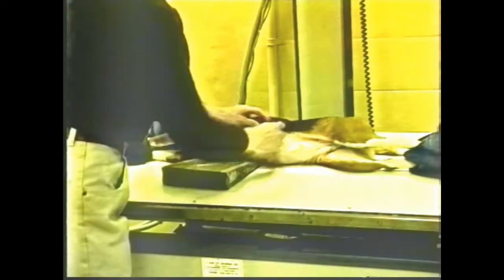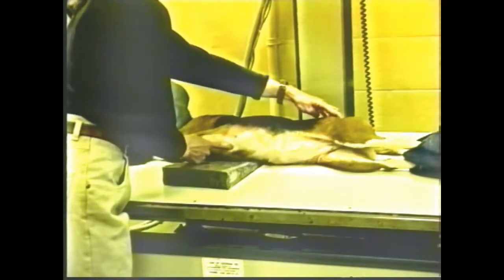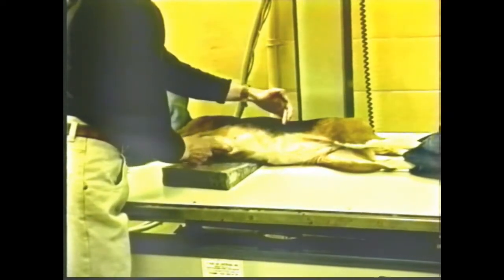The thorax is the control of the cranial abdomen for positioning, while the pelvis is the control of the caudal abdomen. The beam is centered over the umbilicus of the animal, and the film must extend from the xiphoid of the sternum to the hip joint. The actual exposure should be made on expiration during the long quiescent phase. Watch the animal and time the exposure properly.